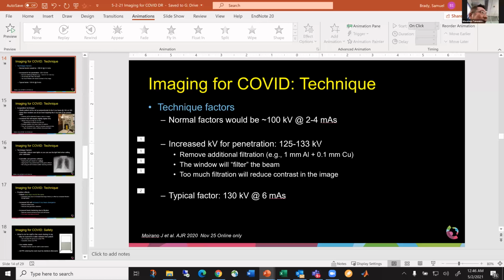So what technique do you use at the field hospital? Do your technologists increase the kV and adjust the mA level as well, or do you know? No, I don't, because we are radiologists. Sometimes we don't know. But I observe that this is the problem.